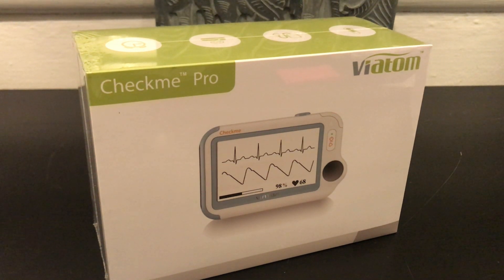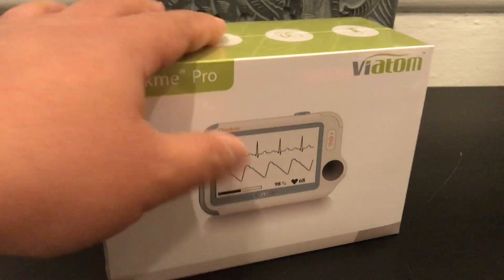Hi everyone, today we're going to learn how to use the Check Me Pro EKG device by Viatom. It is a portable EKG device that also checks for your oxygen level, temperature, and sleep apnea. Okay, let's go.